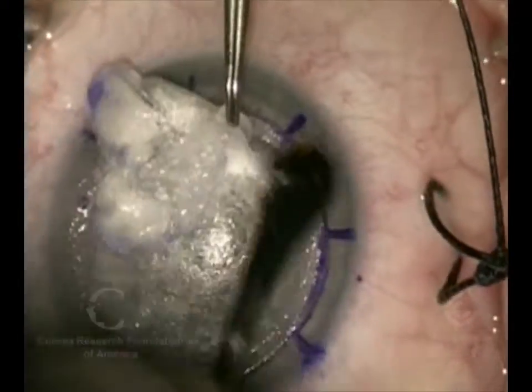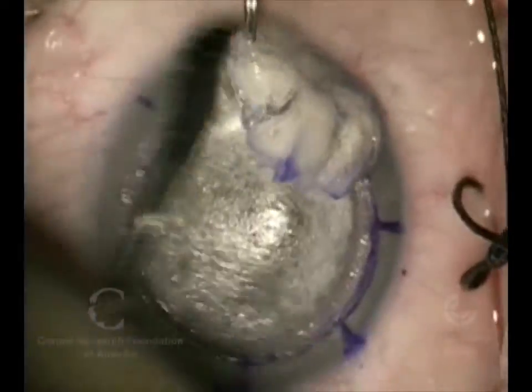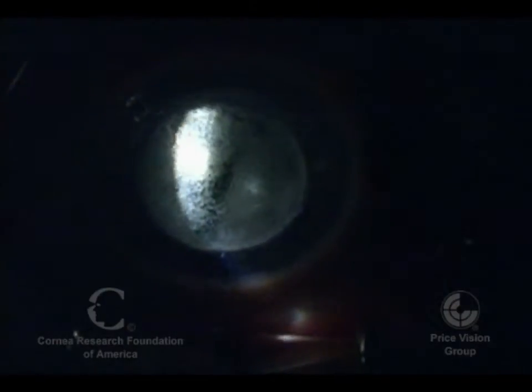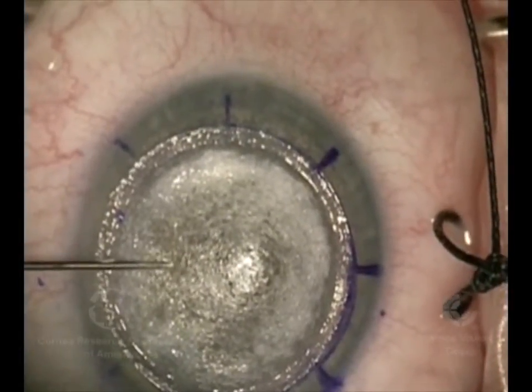The next step is to make a small incision in the central part of the remaining cornea and take that down to the bubble. Before we do that, we're going to shine a light on the eye. This is a technique we came up with at Price Vision Group to verify that we actually have a bubble formation. It gives us a kind of reverse movement of the inner reflection compared to the outer reflection, verifying that a bubble has formed between the inner and outer layers of the cornea.